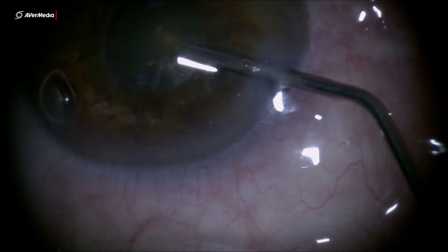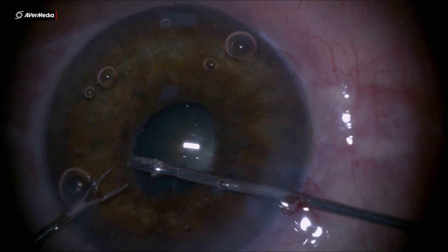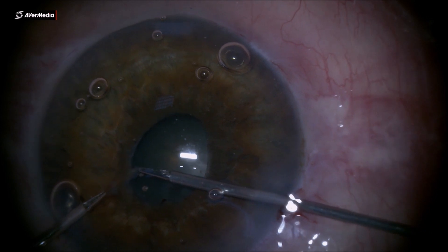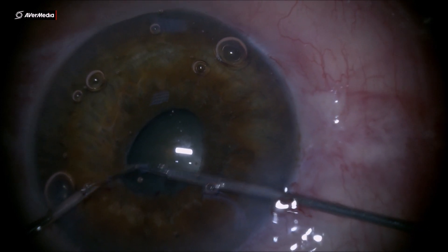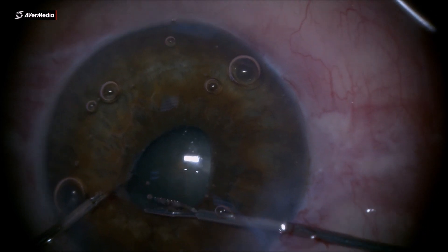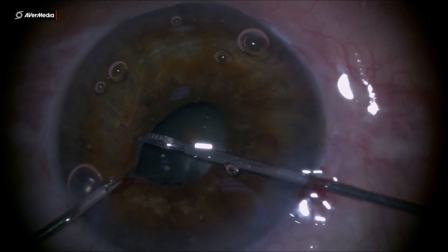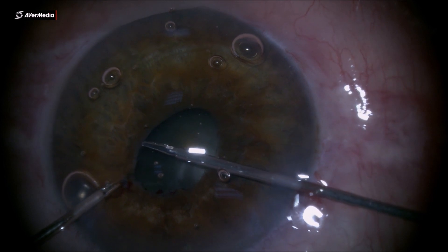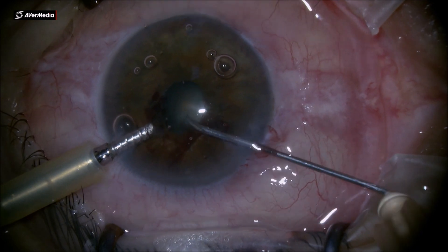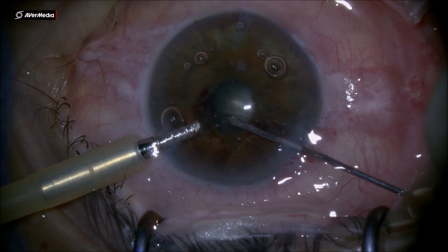It's not coming out in one piece as usually goes in these cases, so I only end up with small bleeding, breaking those neovessels at the pupillary margins. The pupil is not dilating much — it's a very floppy iris in this case, as you will see in a moment, and having a small pupil makes it even more challenging.